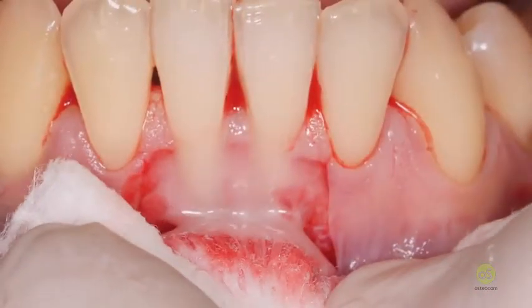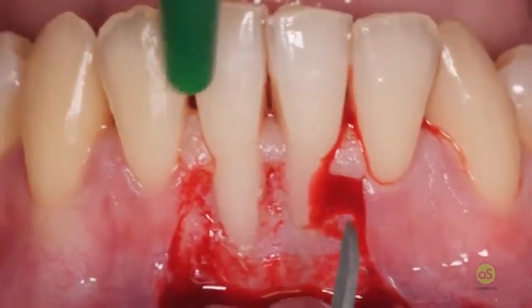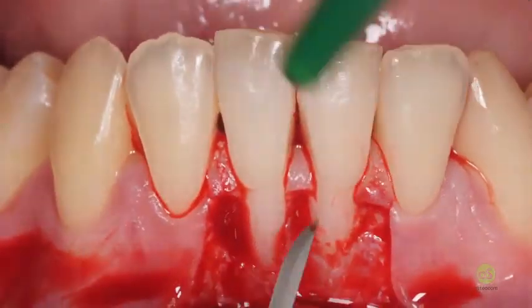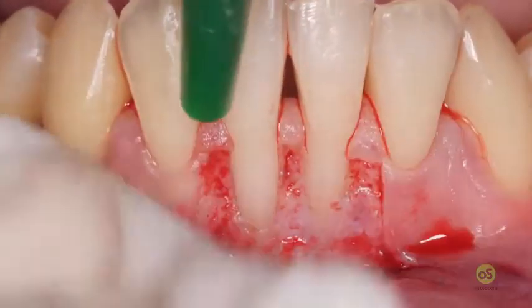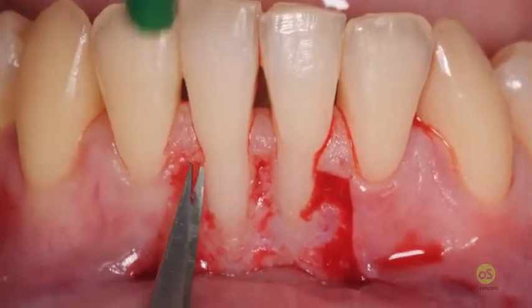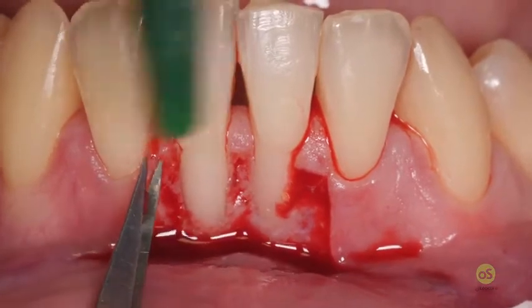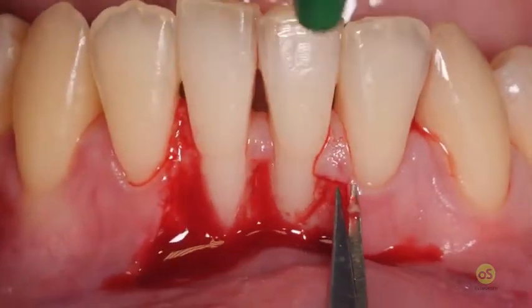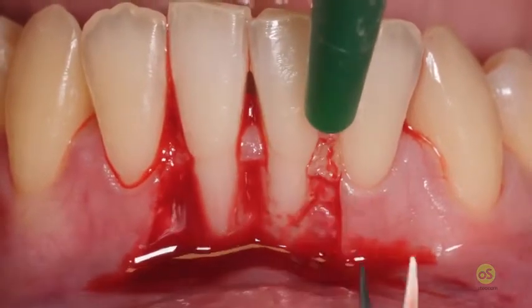Now we are preparing ourselves for the desepithelialization of the papilla. So now we start with the desepithelialization, just the base with the blade, and 90% is done with the microsurgical scissors, because this is an extremely small papilla, and almost all the desepithelialization of this papilla is done with the scissors, because this is done mainly horizontally towards the lingual aspect. As much as you are able to extend the desepithelialization.